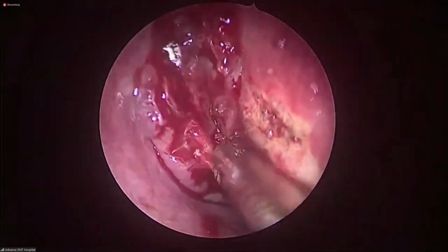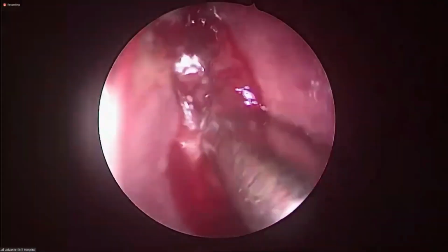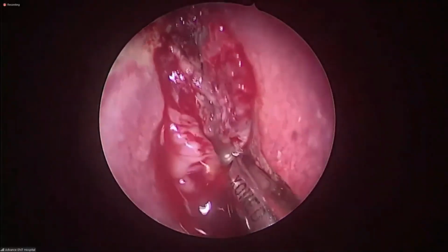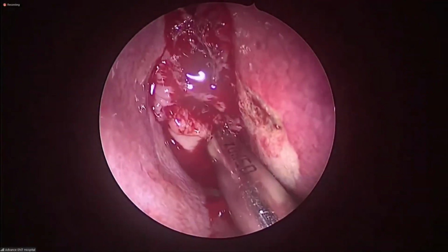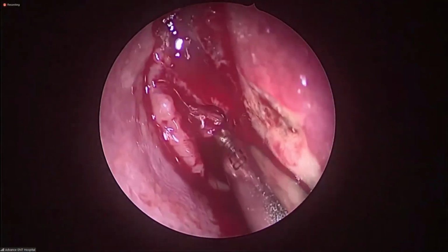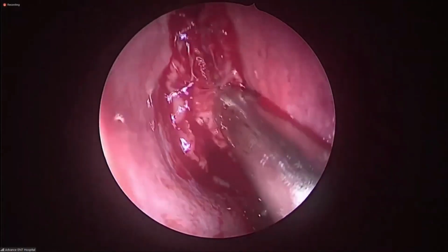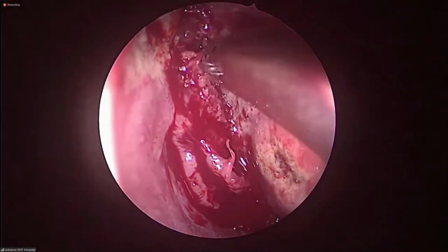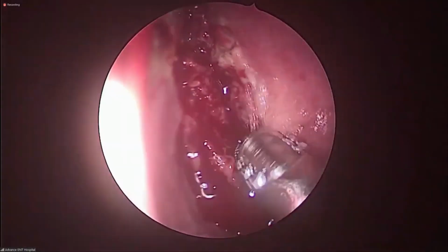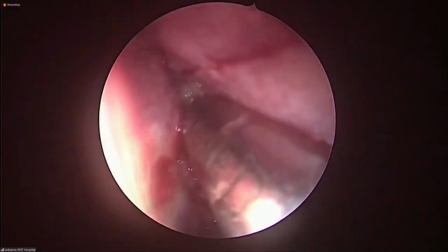See the massive polyposis, no landmark. Yes, sir. Everything has transformed into polyp. That looks like uncinate, but no definite landmark for anything so far.